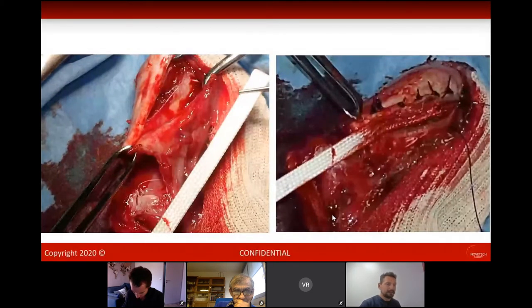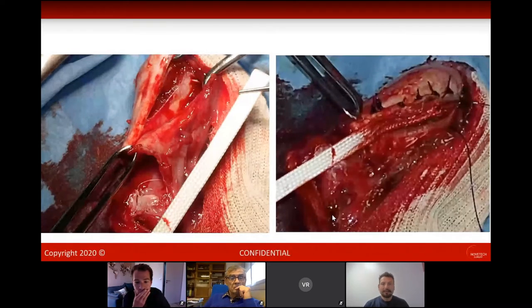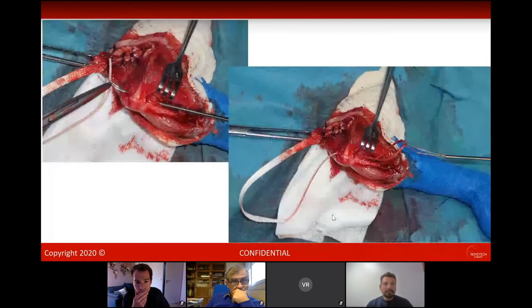And this is a clever part, I think, that Philippe found. We will stitch the prosthesis in the groove that we made by opening the muscle and the tendon. We put the tendon in the groove, and then with classical PDS 2.0 and X-style stitches on each side of the muscle. Then I close the muscle and the ligament over. Once done, we use a guide wire to pass the prosthesis through the canal. It works quite well, even with a 2.7 millimeter tunnel.